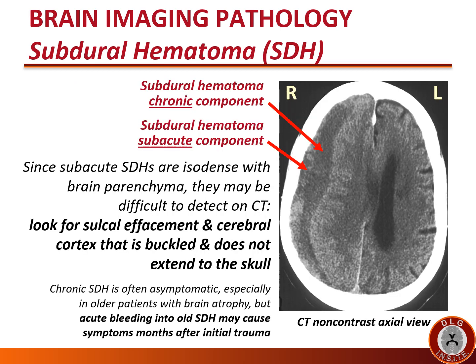This CT without contrast is from a patient with two right subdural hematomas at different periods. The chronic component is darker and hypodense, adjacent to the cerebral cortex. The subacute component is more isodense and closer to the bone, lateral to the old chronic hematoma. Since subacute subdural hematomas are isodense with brain parenchyma, they may be difficult to detect on CT — look for sulcal effacement and a buckled cerebral cortex that does not extend to the skull. Chronic subdural hematomas are often asymptomatic, especially in older patients with brain atrophy, but acute bleeding into an old subdural hematoma may cause symptoms months after initial trauma.